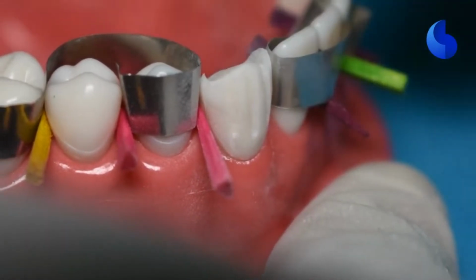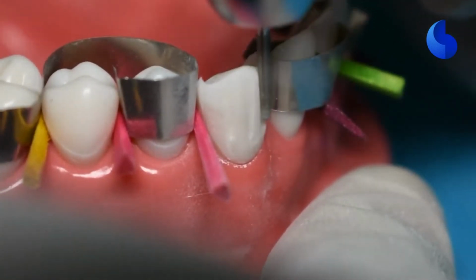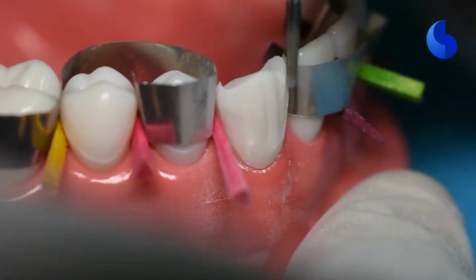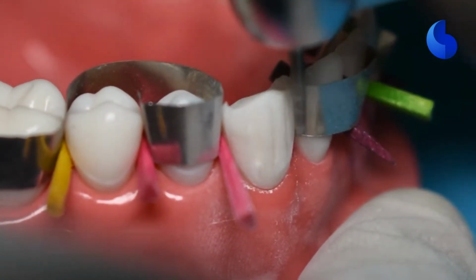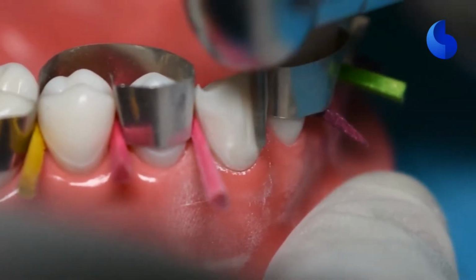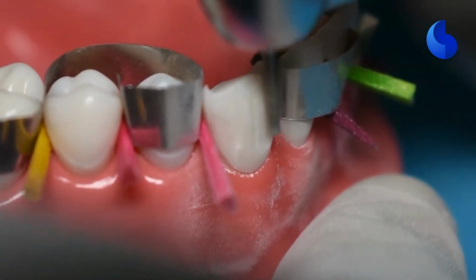Once you've placed these depth grooves, you can go ahead and continue to use your 856-016 burr to reduce the islands of tooth structure between these depth grooves. Now remember that there are 2 planes in which you reduce this tooth structure. One plane is in your cervical component, which is parallel to the proposed path of placement. And then there's the incisal component, and that is parallel to the original external facial contour of the tooth.